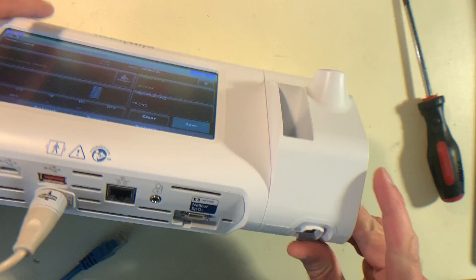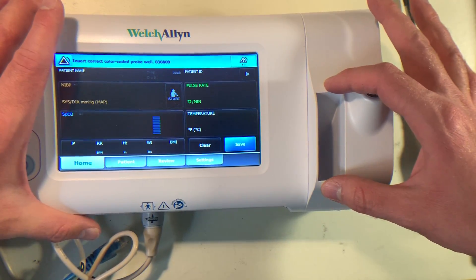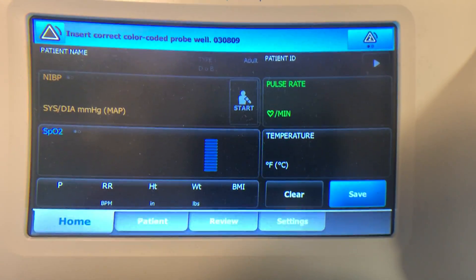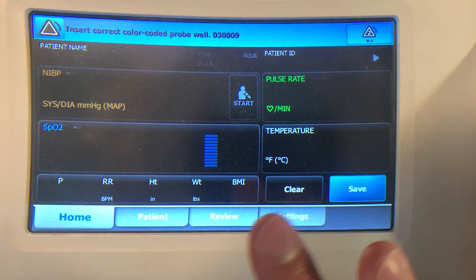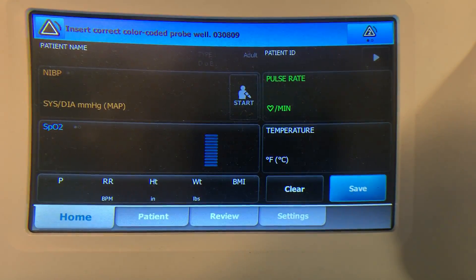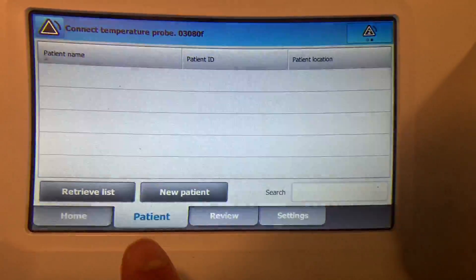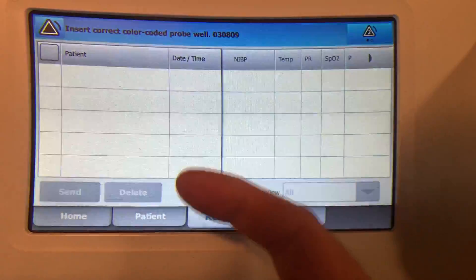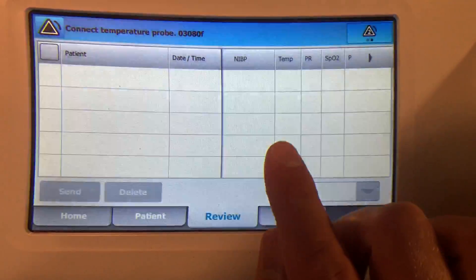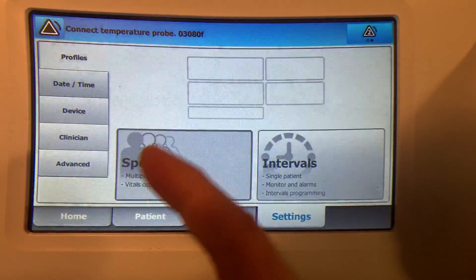The temperature probe, by the way, would connect down here and would sit inside of this device, and you'd have the plastic shields in this holder right there. So you can see it doesn't have the temperature probe and doesn't have ethernet or internet or anything like that. The main controls down here — you have a patient area where you would enter in patient information that could be sent to a database. You have the review which will give you a listing of all of the patients and their measurements that you could then send to a database. You have your main settings page where a lot of the typical stuff is, and you can set the date and time.